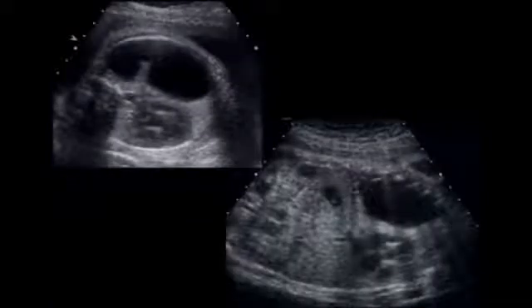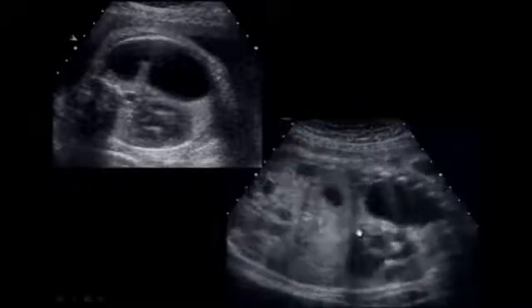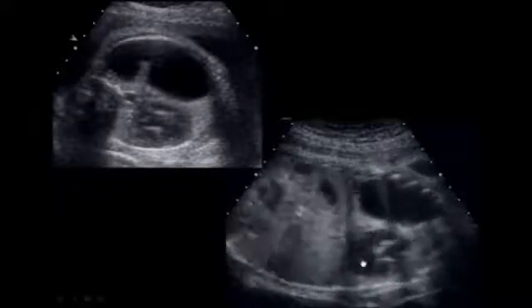Here's an example of the type 1 or the large cyst. Now initially when you look at this study, you could think to yourself, gosh, this sure looks like the C-shaped stomach that we see in the chest during a diaphragmatic hernia. And here's the heart being pushed off to the right side. However, if we go to a coronal image, which is the way you should be looking at all of your chest lesions to evaluate the diaphragm, we can see that the diaphragm is intact. It runs across this hypoechoic line all the way across under the heart, and it is intact, and this is certainly not a diaphragmatic hernia.